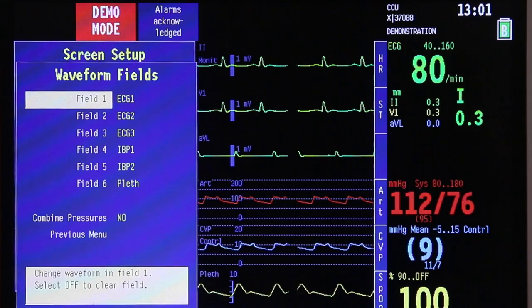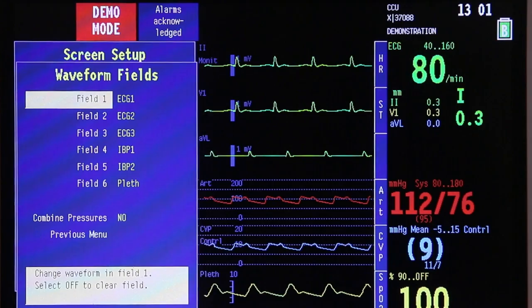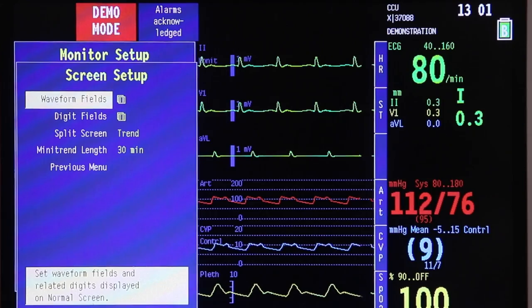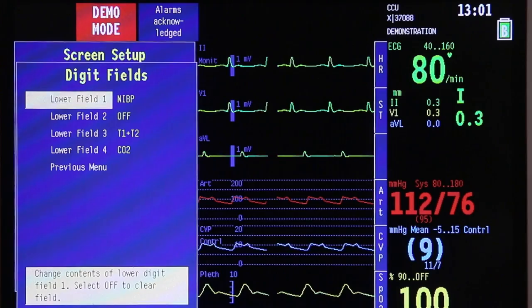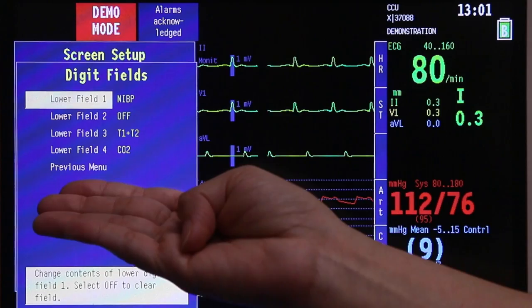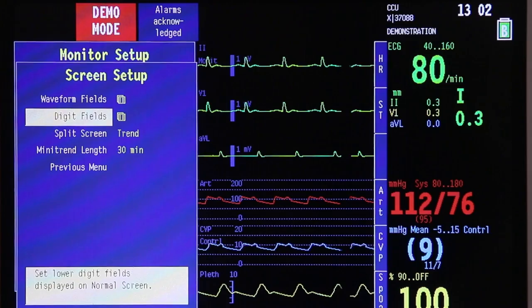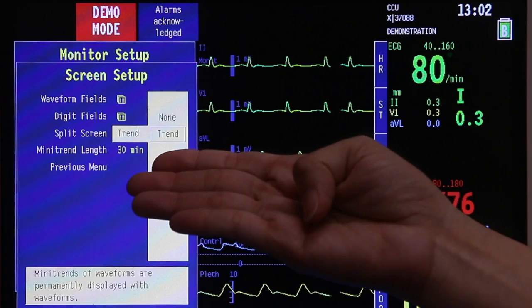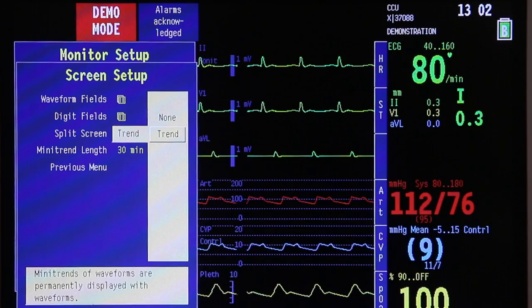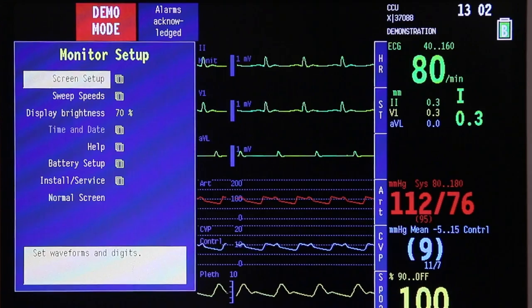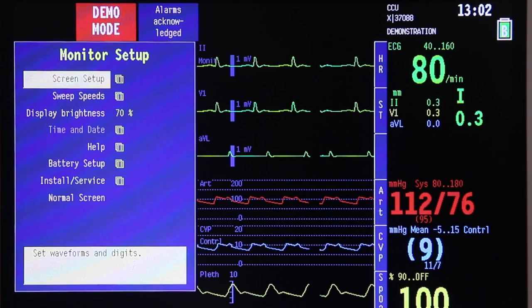Under waveform fields, you will have the option to choose what parameters you want to see on your monitor. Once done, go back to previous menu, scroll down to digit fields, and press once again. Under digit fields, it will ask you what parameters you want on the lower field of your screen. Once done, go back to previous menu. Then go on to split screen — scroll down and press the trim knob once. It will ask you whether you want a trending or no trend. If you choose no trend, click none and go back, then return to previous menu and back to normal screen.